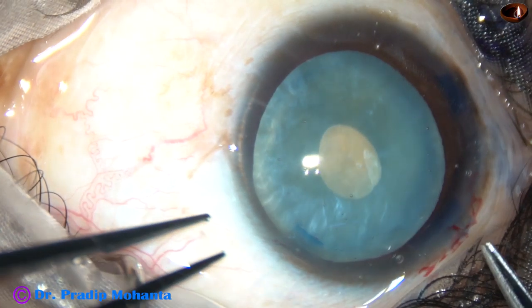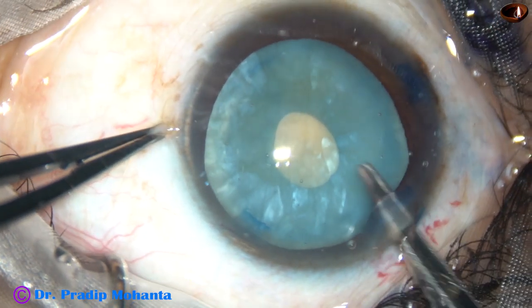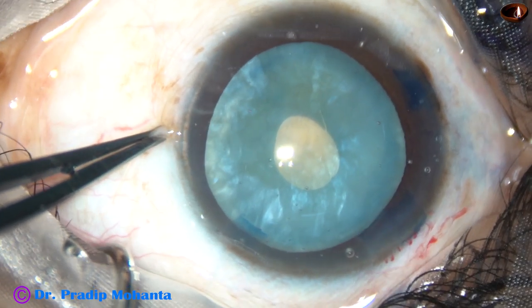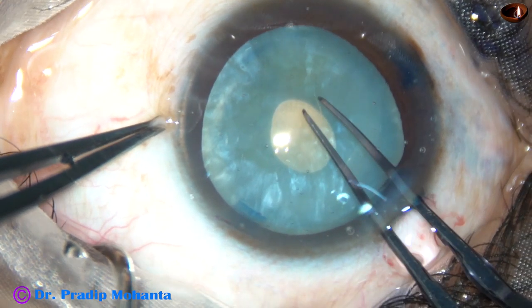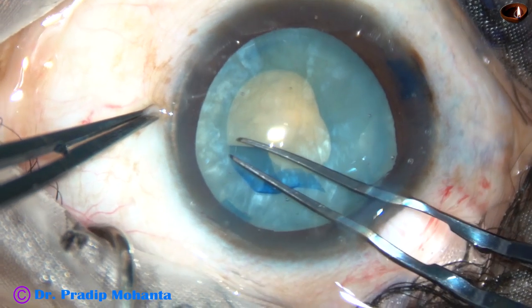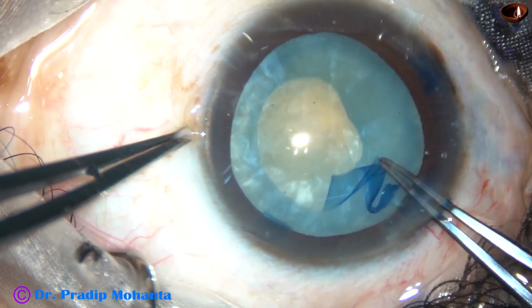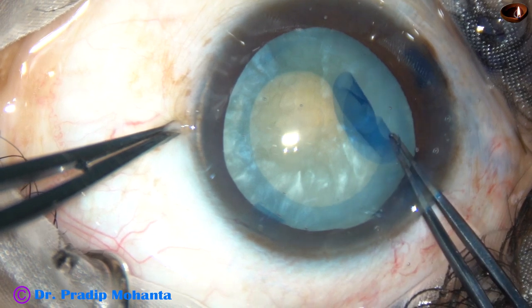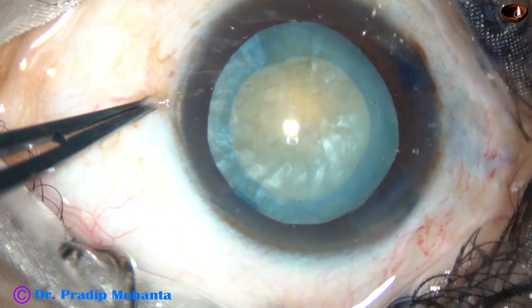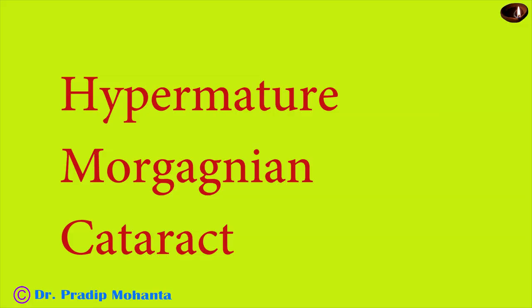A Vannas scissor is taken and a small oblique cut is made at the margin of this mini rhexis. The Utrata is taken again and this small rhexis is enlarged into an optimum-sized capsulorhexis. And this is the most tricky part of intumescent cataracts.